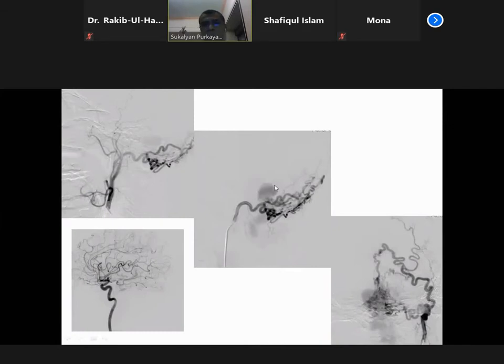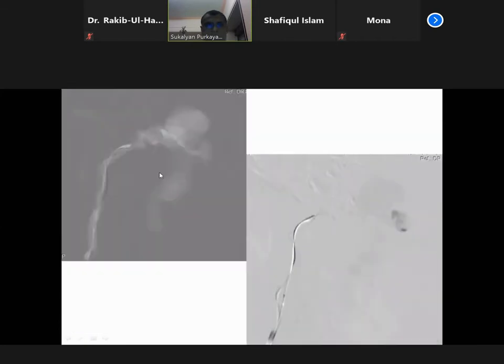And you see all the areas. This is the first venous sac which arises. So you can be certainly sure that this is the area which you have to treat. Now, there are two catheters. One is detachable and probably another is a coiling catheter, which we took.